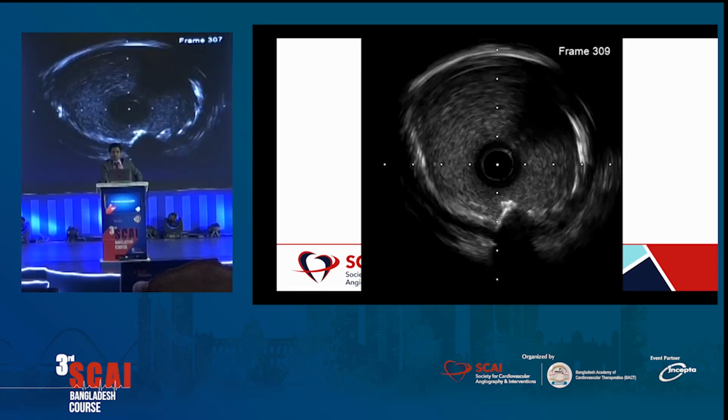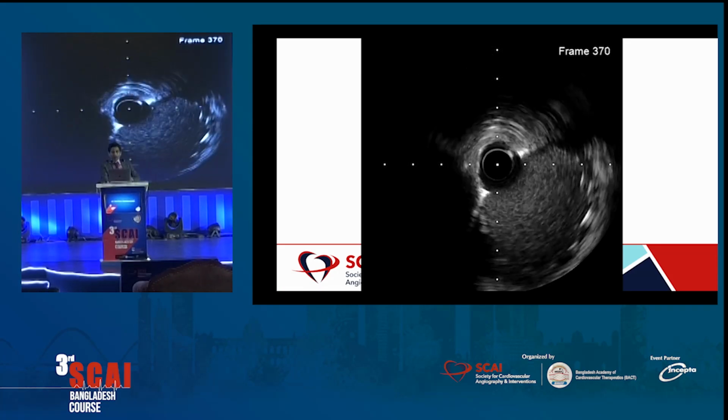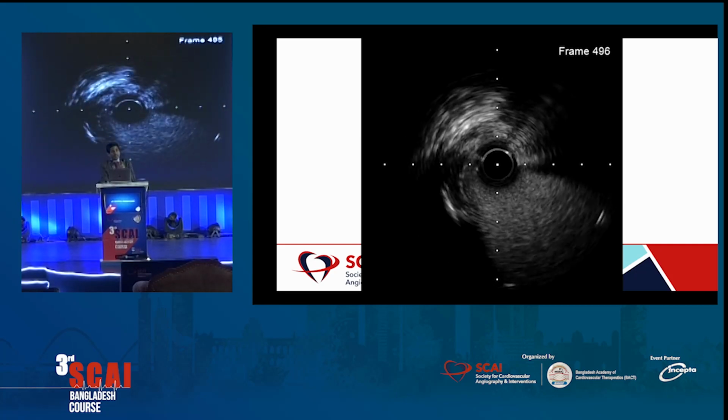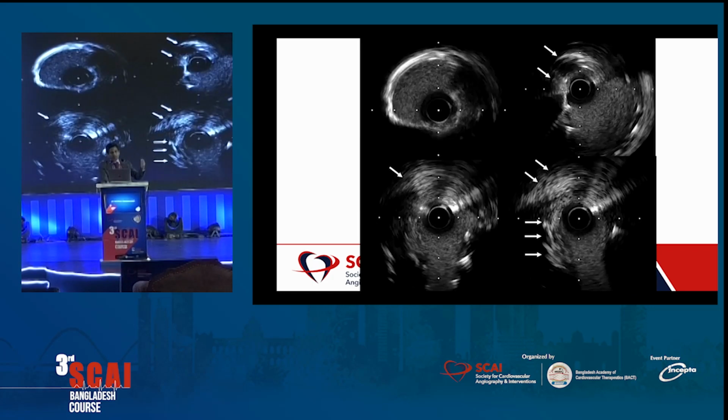and what we found was, you could see here, the ostium is covered well, and there was no restenosis within the stent, but there was an external compression of the stent from a calcified nodule which had developed since 2019. So you could see here, there's not much disease within the stent, but what we are seeing is a compression of the stent from external calcium nodule.